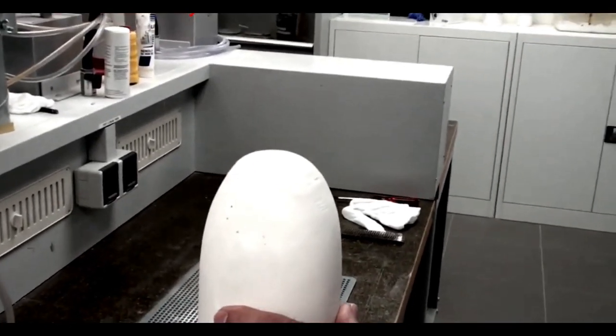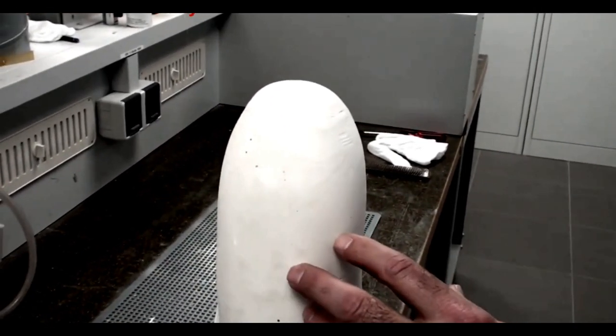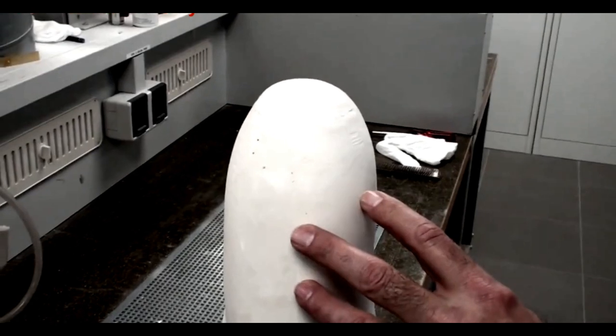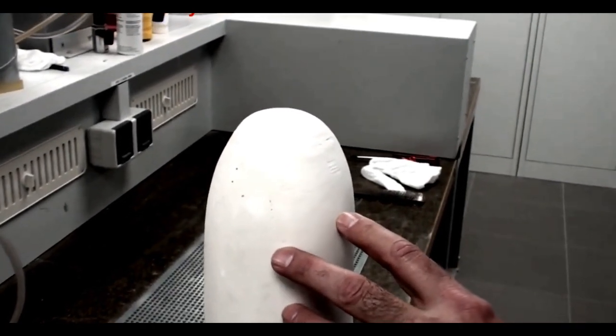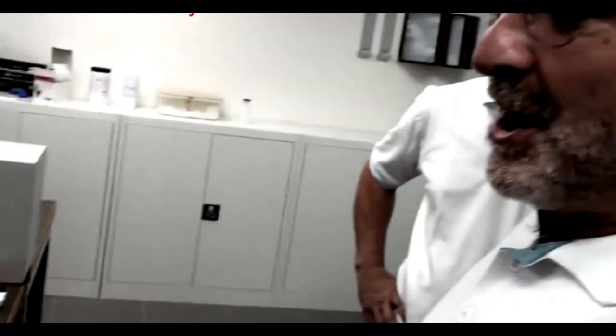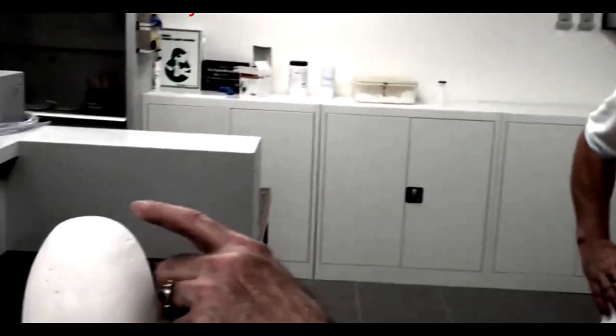One of the simpler things about the DVS system is that it requires no special plaster technique. You can design your socket in any style you're comfortable with. What's really important if you're using a total surface weight bearing approach is to do no reduction at the distal end.